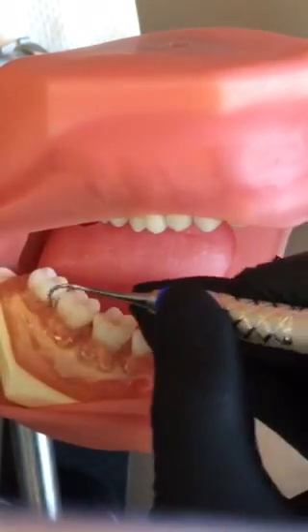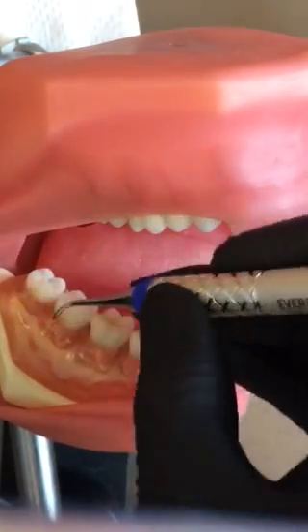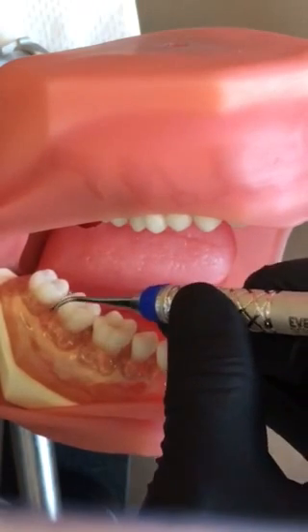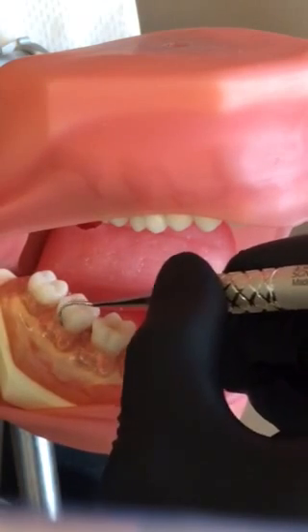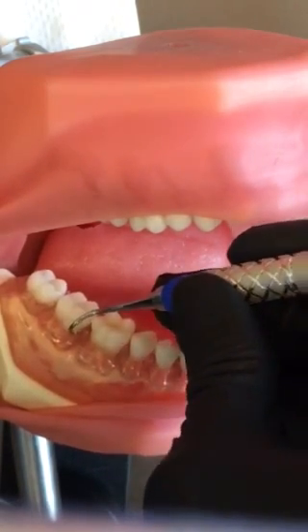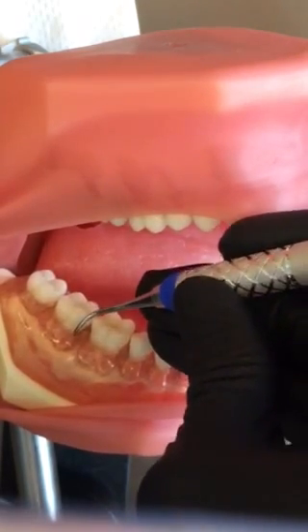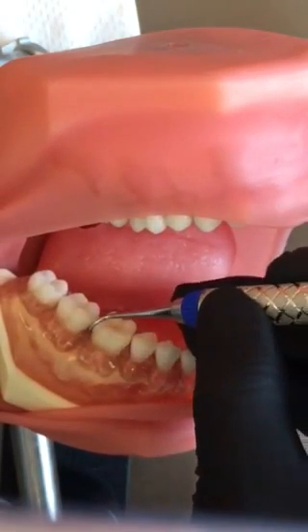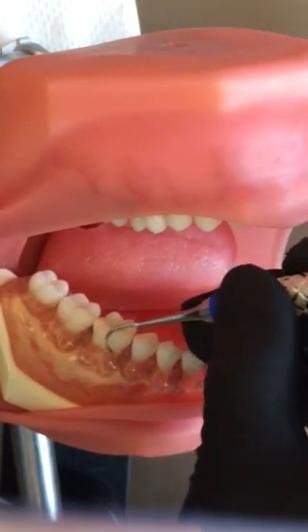If you are on your typodont and you're getting that sound, then your blade is engaged — you won't get that sound on real enamel. Distal line angle. Roll. This should look very familiar to you because this is very similar to what we do with the 1112 Explorer. Distal line angle. Lead with my tip. Oblique strokes across the buccal.